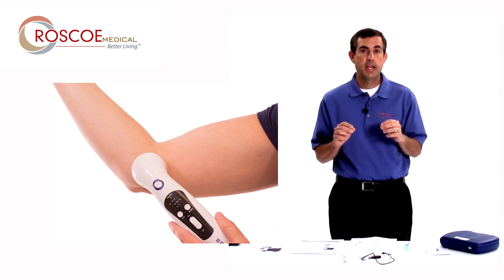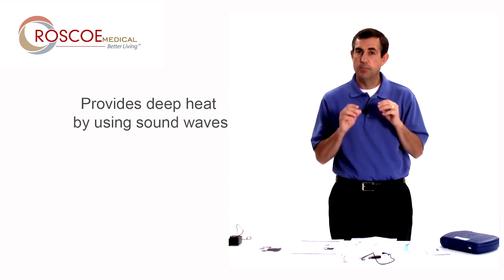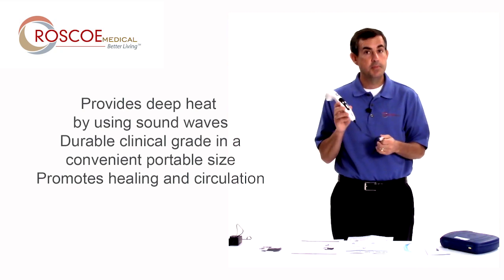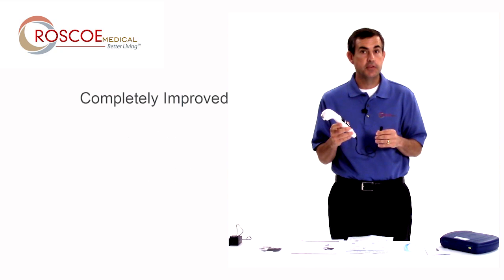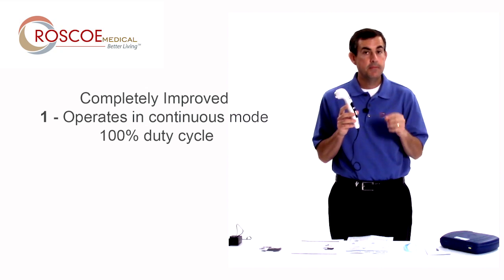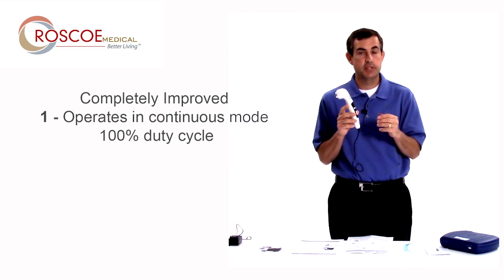Well, we improved it and it isn't just a few things we did — we did a lot of things to make this a completely different and better unit. You'll notice that it looks very similar to the first version, but make no mistake, there are a lot of key differences. The first difference is instead of just operating in pulsed mode like the first edition did, the US Pro 2000 second edition can operate in continuous mode or 100% duty cycle. That's a big key difference.